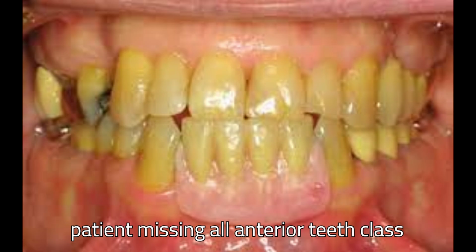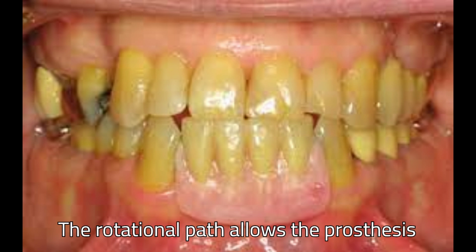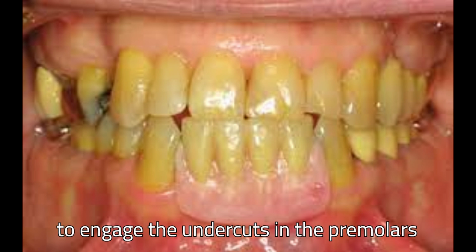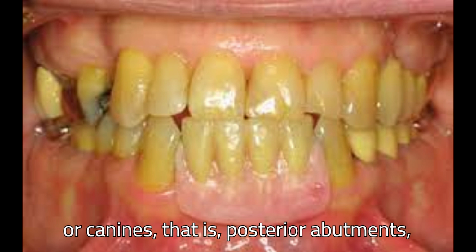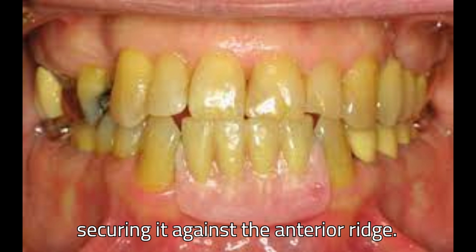A patient missing all anterior teeth, Class 4, might benefit from a rotational RPD. The rotational path allows the prosthesis to engage the undercuts in the premolars or canines, that is, posterior abutments, rotating the prosthesis into place and securing it against the anterior ridge.